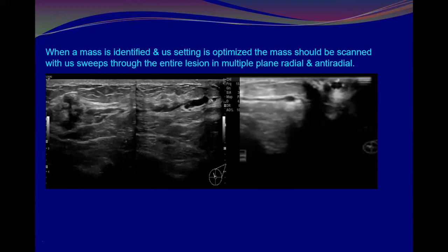But there are other types other than panoramic. We said we have many techniques for extended view. The panoramic, we can use it for measurement.